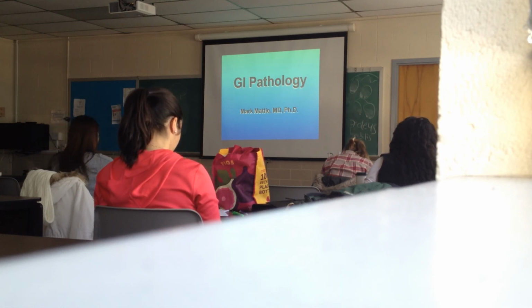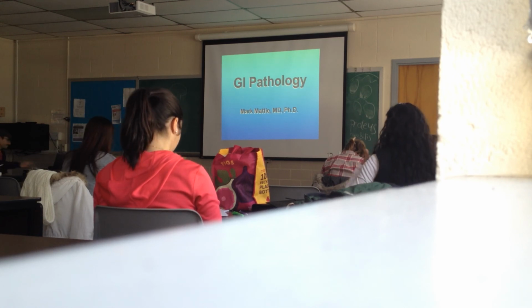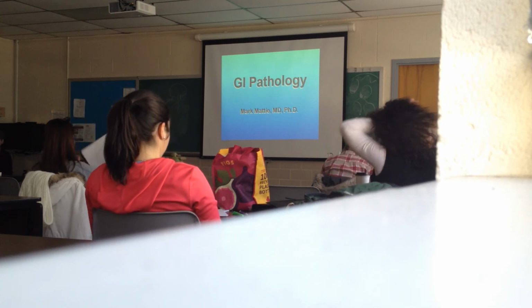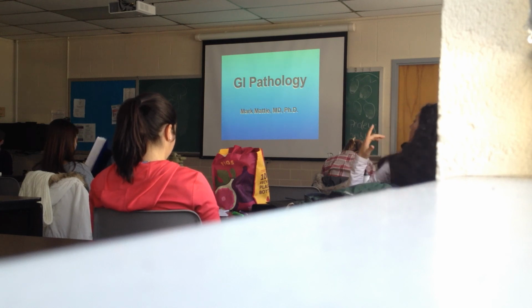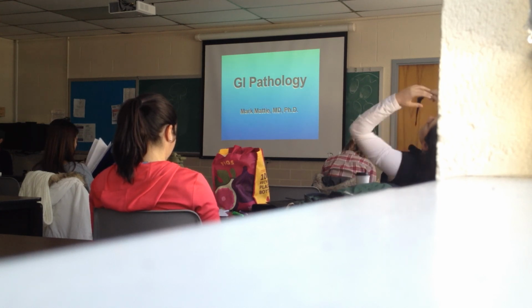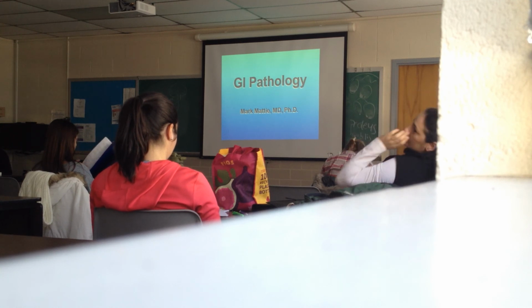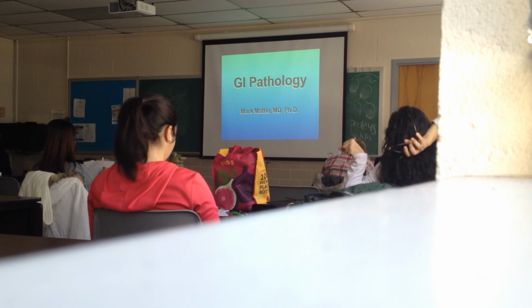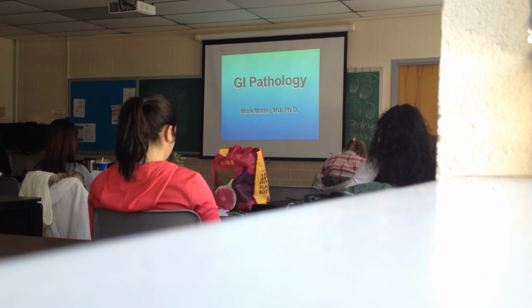You should be able to identify different parts of the GI tract. Make sure you know you're looking at different contrast agents. Shouldn't be too bad. The contrast agents you talked about: air and barium, aside from IV iodine-based.